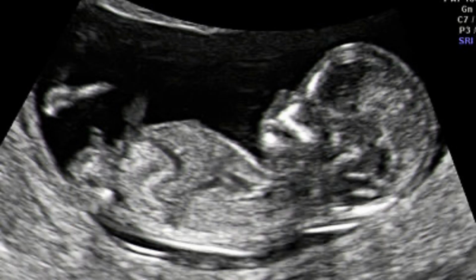And then the lovely longitudinal picture of the baby. So this is the one that we all know and love. And again, like I said earlier, the baby may be positioned several different ways inside the mother's uterus. And so the way that you hold the probe will not be up and down like you see in those other images. You will have to position it and capture the right image based on how the baby is facing.